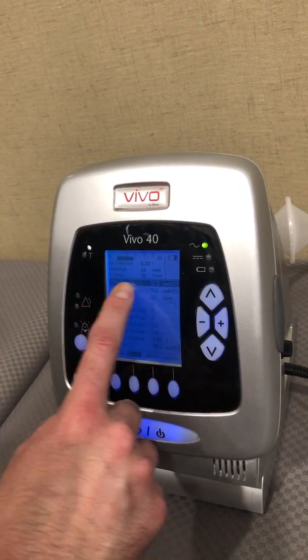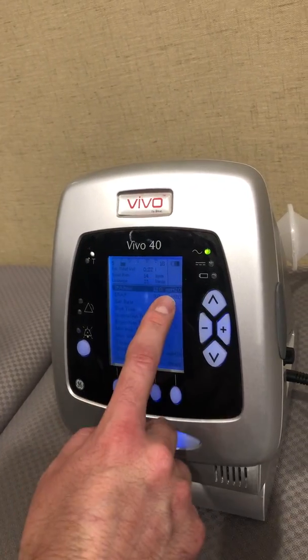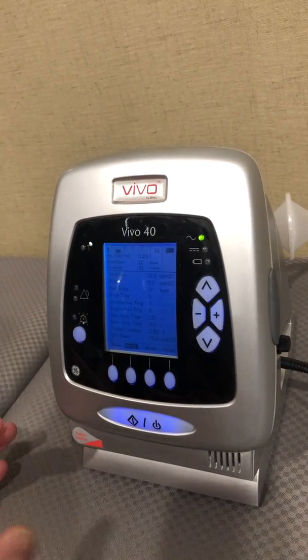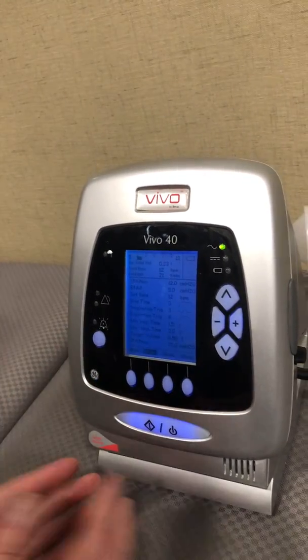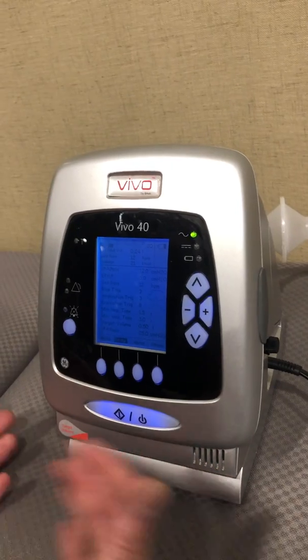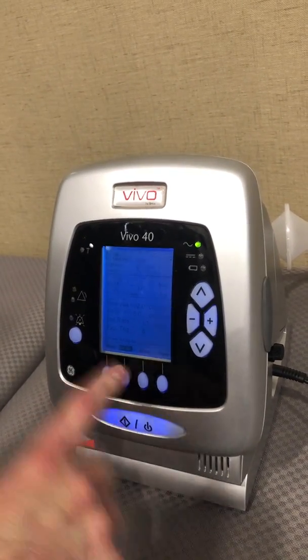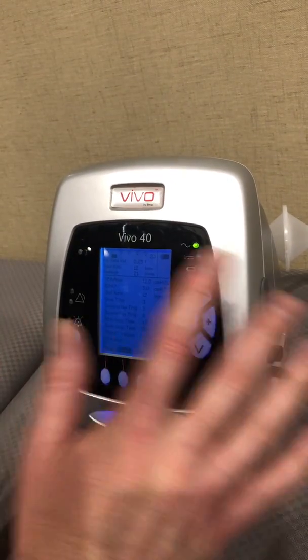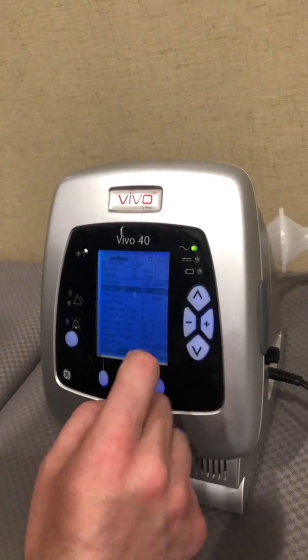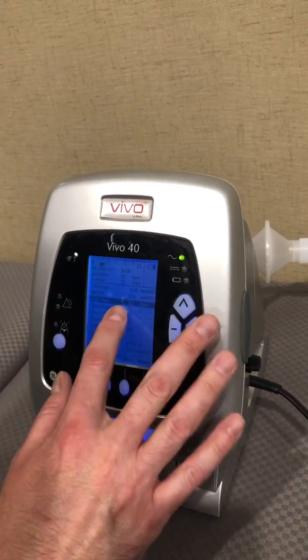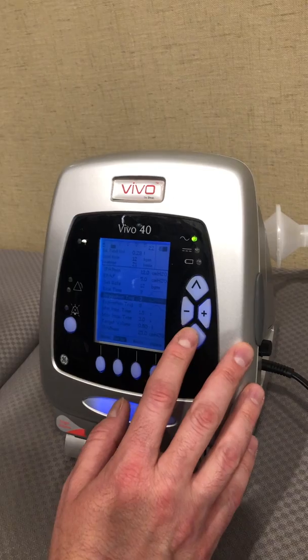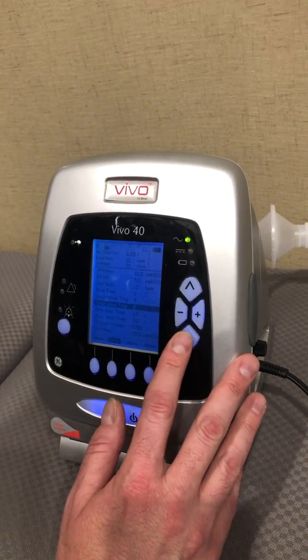We're going to set our IPAP min at 12. Anytime you're using ST with a targeted tidal volume, you need to realize you're starting out in BiPAP mode, so your IPAP min needs to be high enough that when you turn the vent on, it will be comfortable for the patient. That's why we're using 12 — I would never suggest going below 10. We're going to leave our EPAP at 5 and our rate at 12. You can set rise time, inspiration trigger, and expiration trigger — I'll leave those on default values for now.